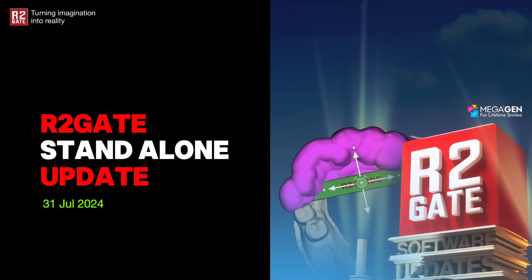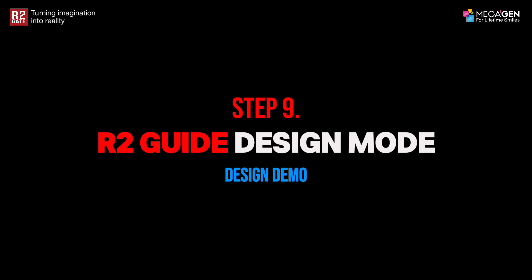Thank you for joining the R2Gate Standalone Update Tutorial. Step 9: R2 Guide Design Demo.